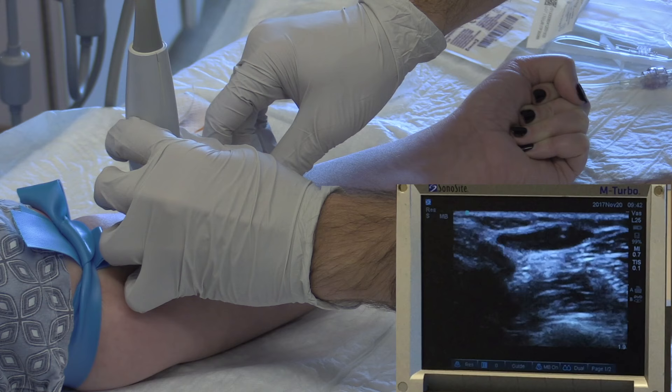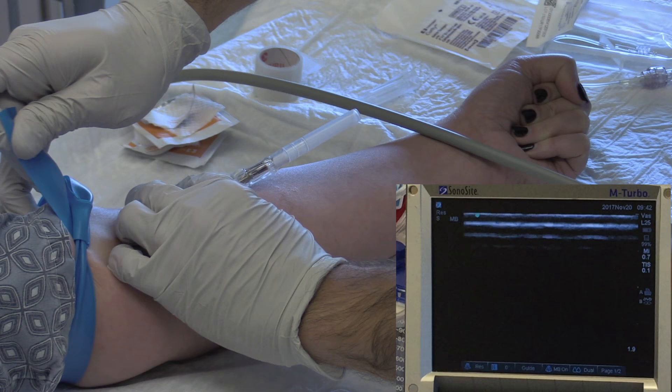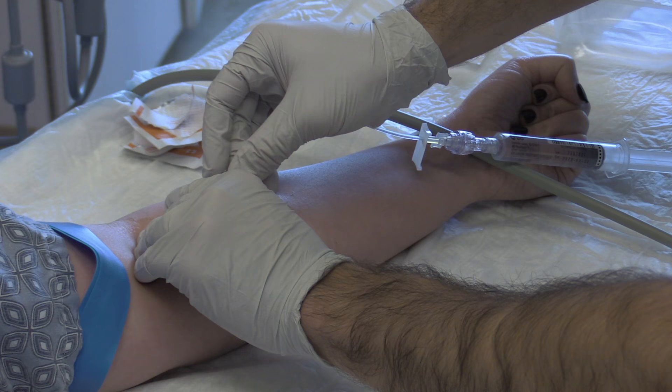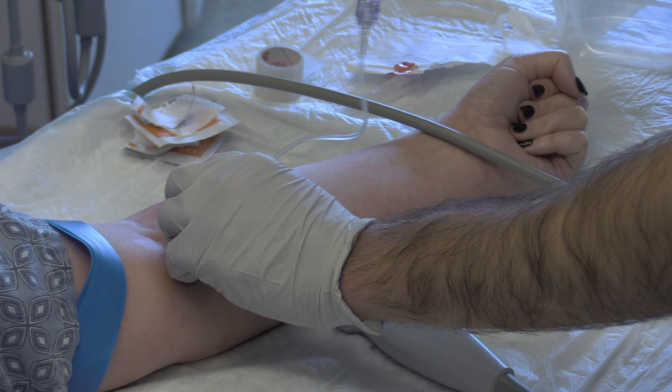Now you can advance your catheter along the needle. Before removing the needle from the catheter, untie your tourniquet and occlude the vessel with your finger to prevent blood loss. Attach your IV extension tubing. Verify placement by drawing back blood, then flush your new IV.